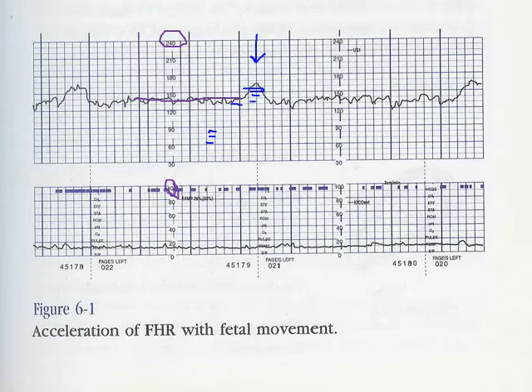The other thing to evaluate is how long does it last? Remember, an acceleration needs to last at least 15 seconds. And remember your lesson, these are each worth 10. So is it lasting 15 seconds? 10, 20, 30. Absolutely. This is an acceleration by definition.